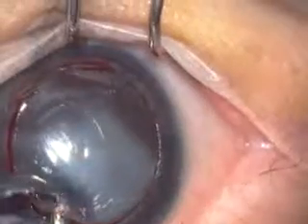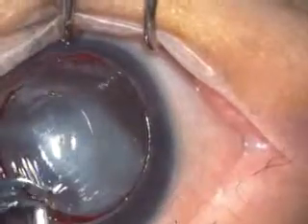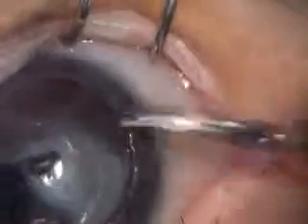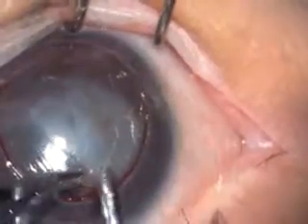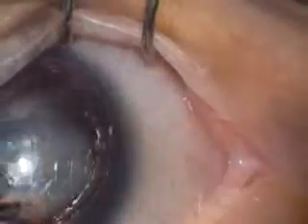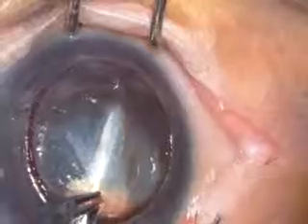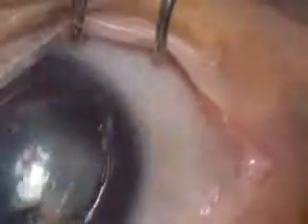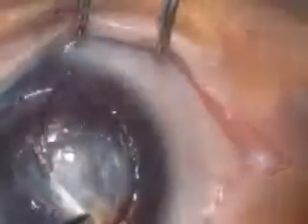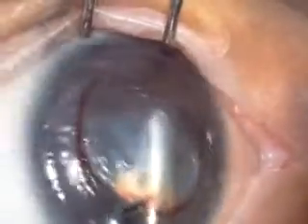Careful partial dissection using DORC dissectors is started along one of the edges in a forward sweeping movement. Difficulty at this point in holding the edge of the thin lamella may be experienced, and it is important to avoid formation of a buttonhole. The dissection is then carried forward and would require a more pronounced force for the sweeping action in the region of the scar. As the dissection proceeds forwards, we should ensure that the tissue is held down with the forceps to maintain the depth of dissection, as lifting of the tissue might cause the dissection to move in a more superficial plane.